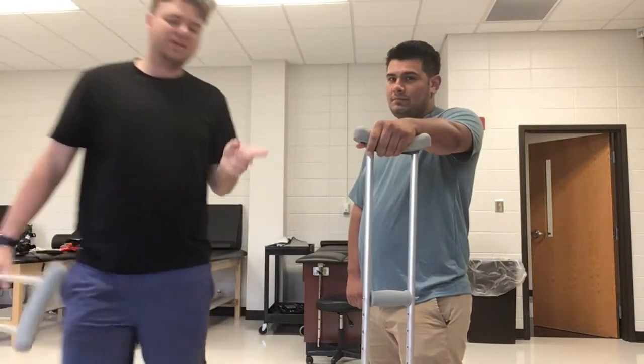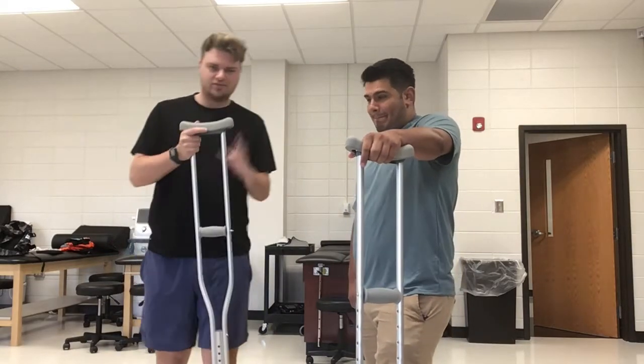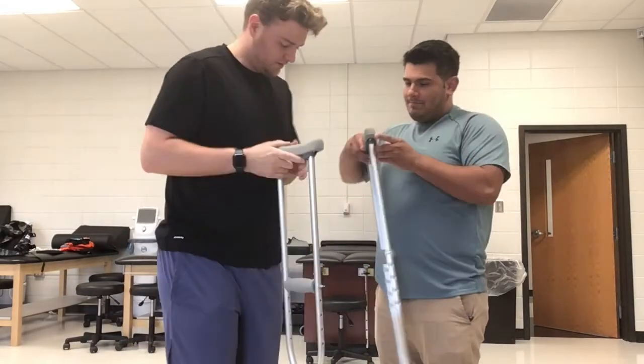All right, so we've got our athlete Marcus here. He has injured his leg, so we've got to put him on some crutches. So we're going to go ahead and get him fitted. So I'll have you stand straight up.